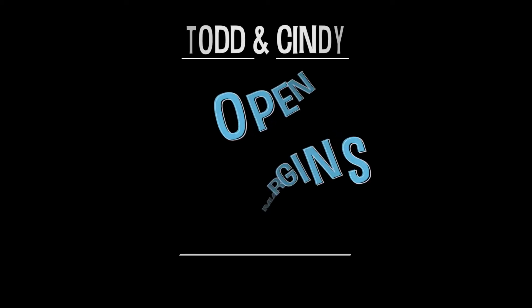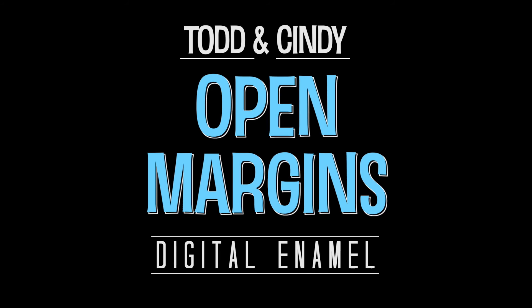If you are an Omnicam user looking to move to PrimeScan, you're not going to make a wrong decision moving up to the Ferrari of scanners. PrimeScan versus Omnicam.